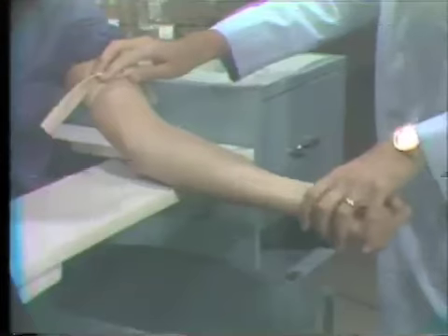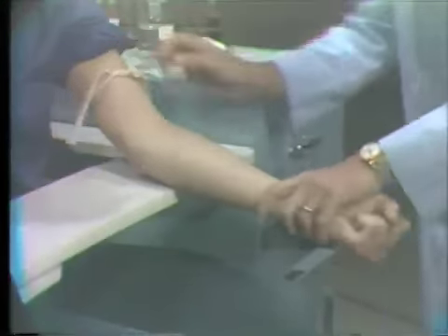Coming to the patient now, proper application of the tourniquet. Again, your finger between the patient's arm and the tourniquet. Tight placement of the tourniquet. Have the patient make a tight fist. Pump 2 or 3 times. And then we'll notice the vessel is rising up.